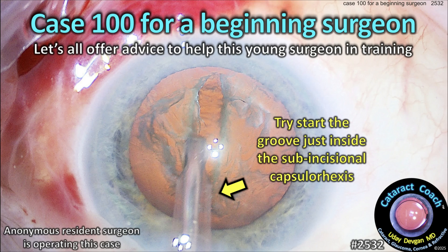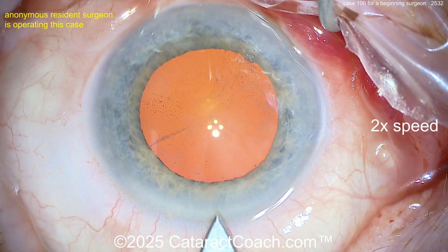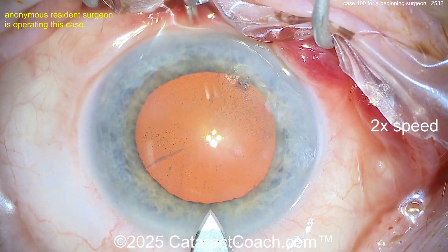cataractcoach.com — case 100 for a beginning surgeon. Let's all offer some advice to help this young surgeon in training. We've sped the video up and we're going to show you case 100 here.